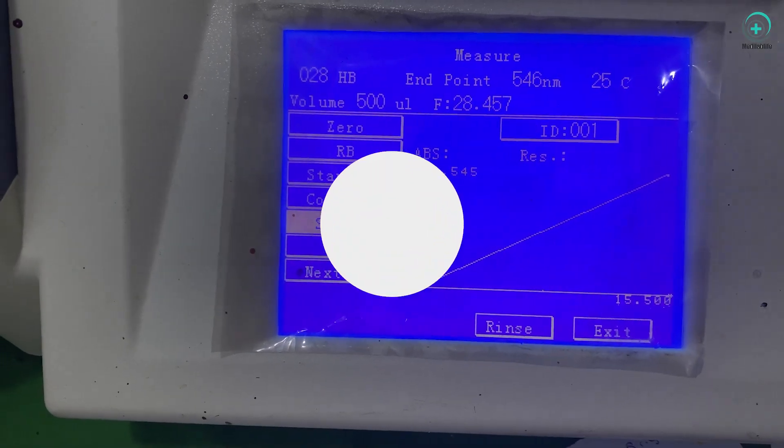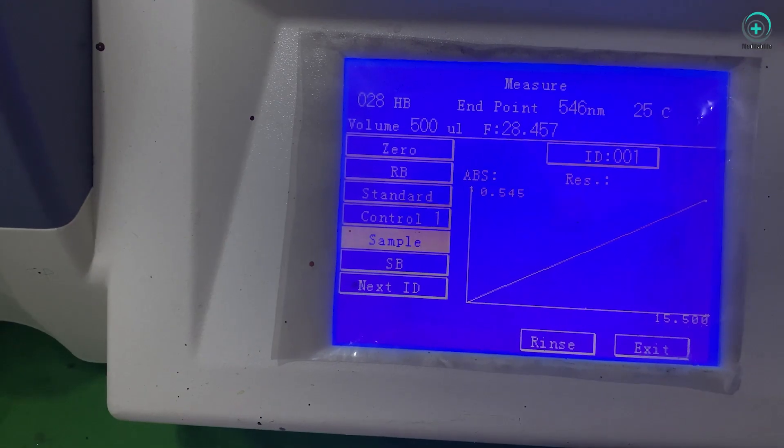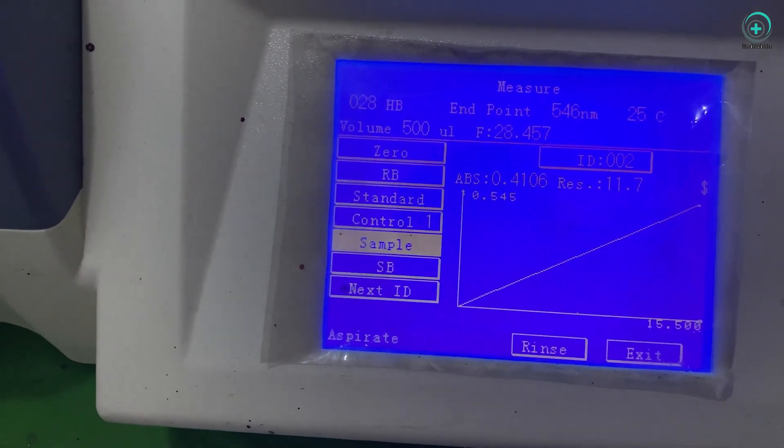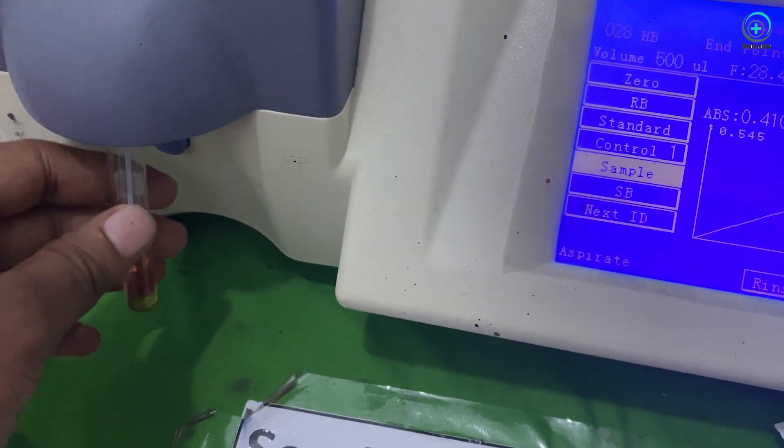Step 7: Observing the result. Interpret the results displayed on the biochemistry analyzer, noting reference ranges and clinical significance.